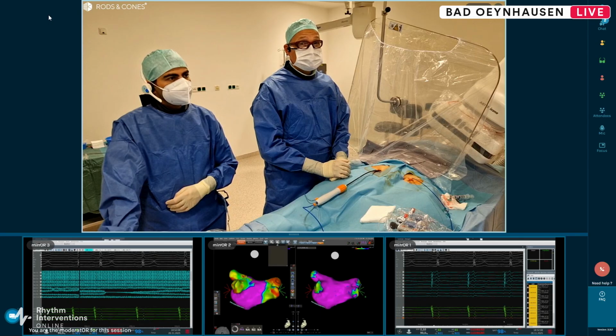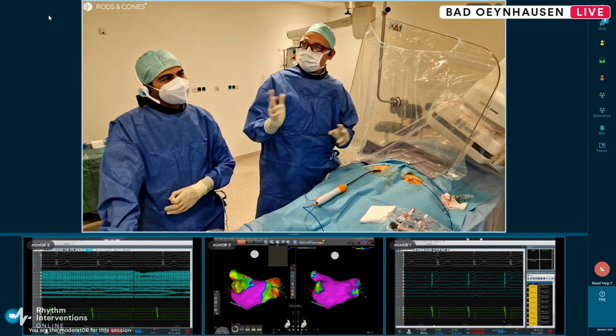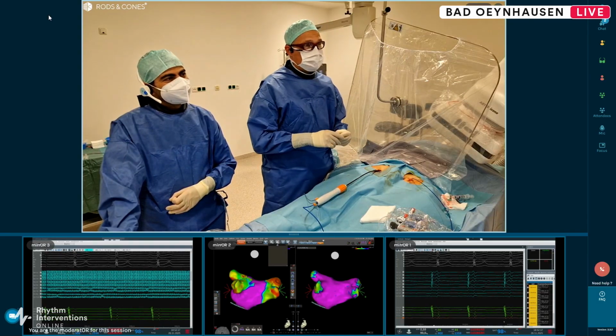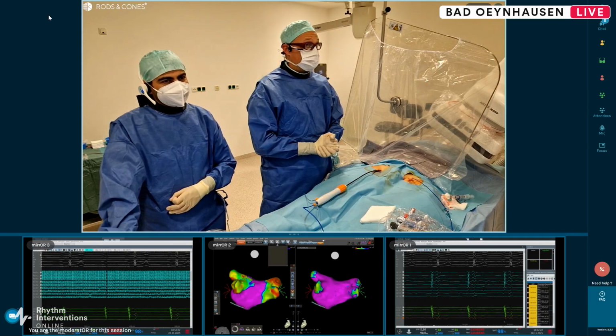But I'm quite sure it's possible that you get hemolysis when you perform what Philip Sommer always calls "ablate like hell syndrome." When you follow this approach, saying I ablate everywhere, then you will get hemolysis and also other collateral damage. I'm quite sure.